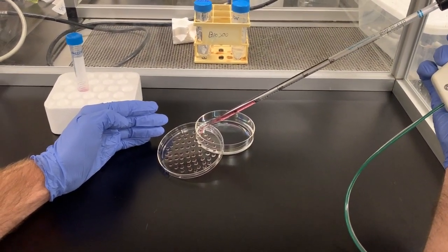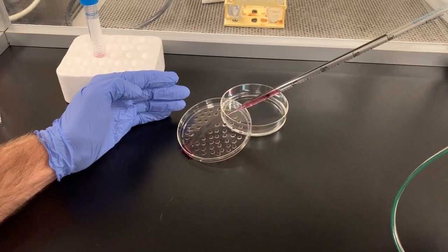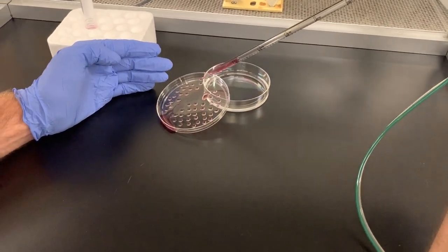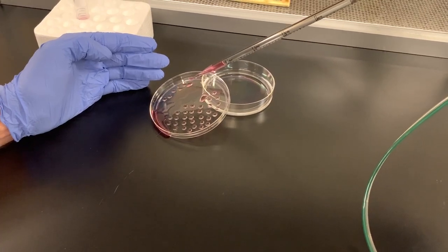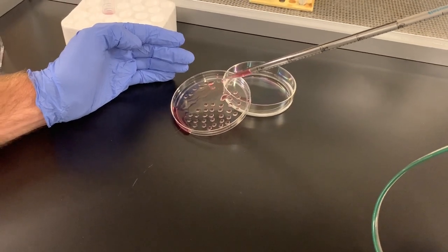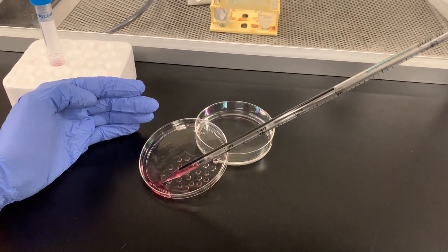Using 2-3 milliliters of media, rinse the drops from the surface of the plate down to the bottom. Be sure to take your time rinsing the bodies from the plate. Hold the plate with the drops at a 45 degree angle and use a sterile pipette tip to gently wash the cells down into the rim of the dish. Be careful not to let the media spill over the rim. You will have to use some of the media which collects at the rim to wash the plate several times until all the EBs are removed from the surface of the dish.